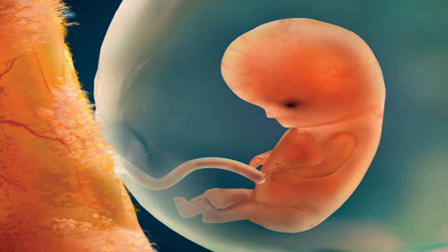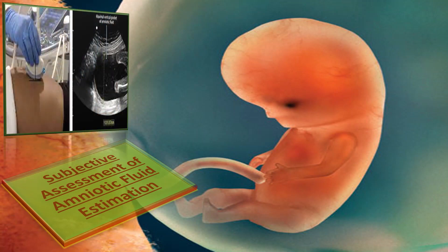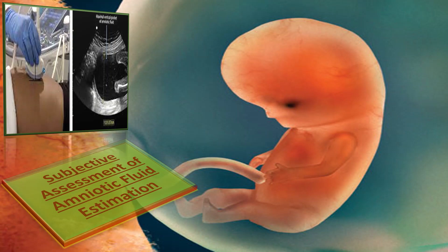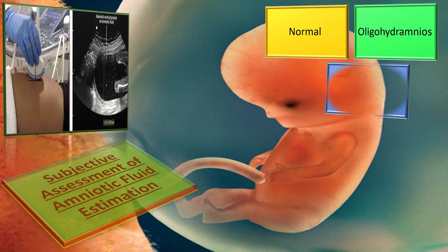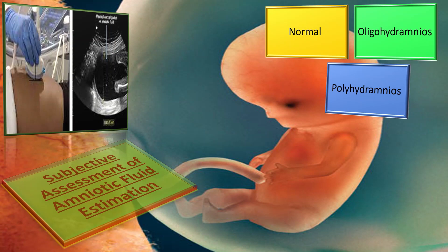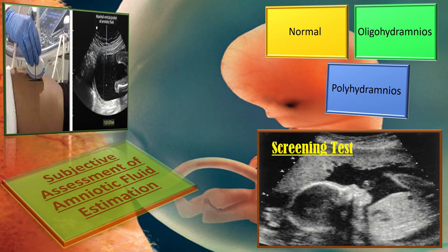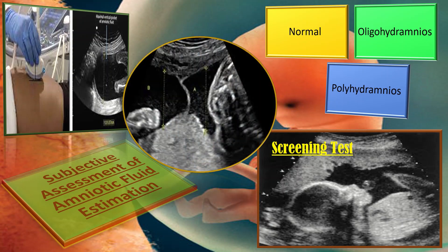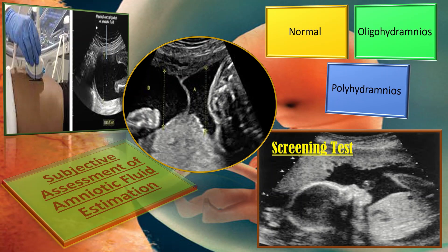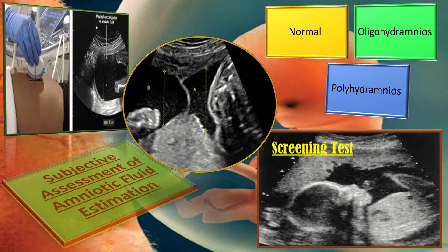How to do the subjective assessment of amniotic fluid? By subjective assessment of amniotic fluid estimation, we mean amniotic fluid evaluation along with biometry measurements and placing it in one of three categories: normal, oligohydramnios, or polyhydramnios. Subjective ultrasonographic assessment of amniotic fluid volume may serve as a screening test for experienced ultrasonographers, but there are many inter- and intra-observer variations. That's why when a decreased or increased amount of amniotic fluid volume is suspected, one may elect to use the amniotic fluid index for confirmation of the subjective impression.